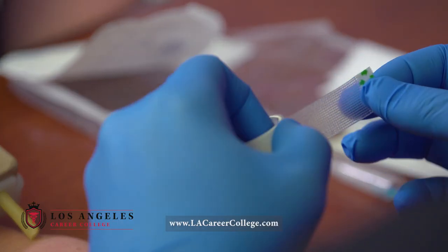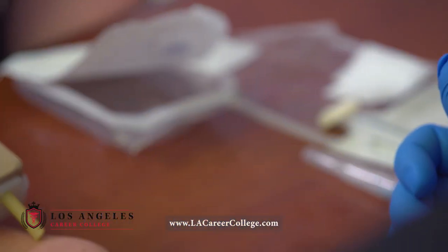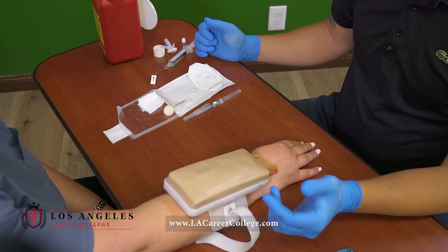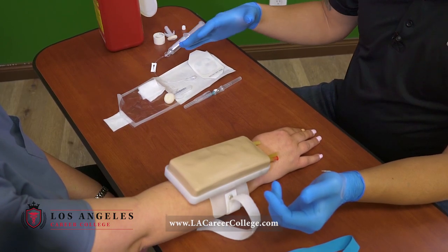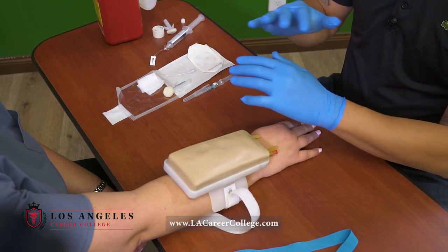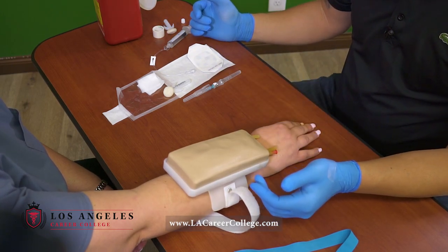I need to get my tape ready. One thing you want to do is make sure when you're starting an IV, all your supplies are on your dominant side. Because when dealing with needles or sharps, you do not want to cross hands. So all the equipment is going to be on our right-hand side.